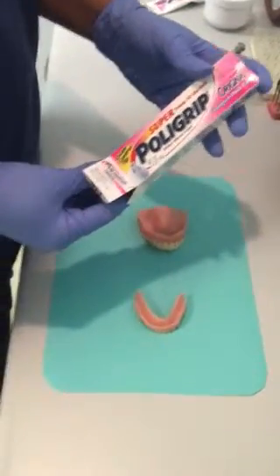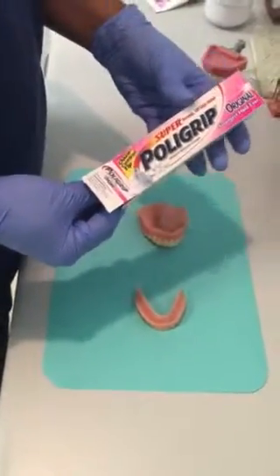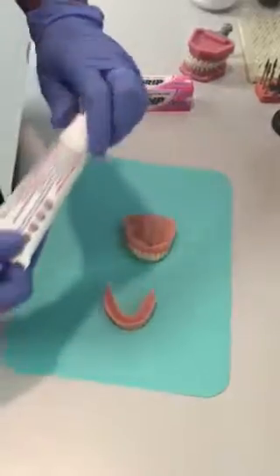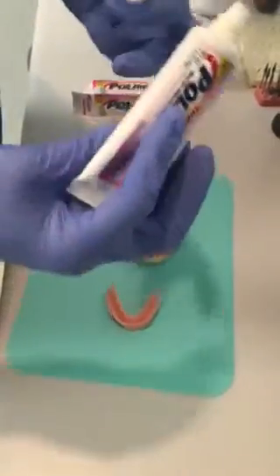We're going to show the placement of denture paste onto the denture. This is a complete denture — a full bottom and full upper — and this is the denture paste.